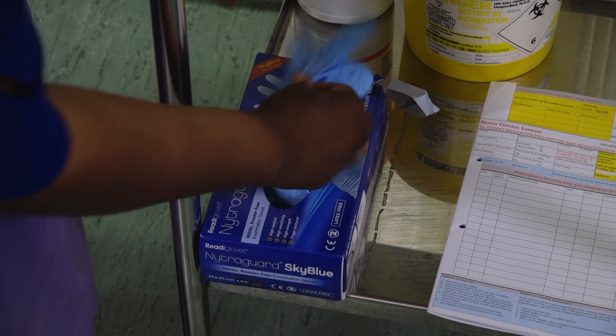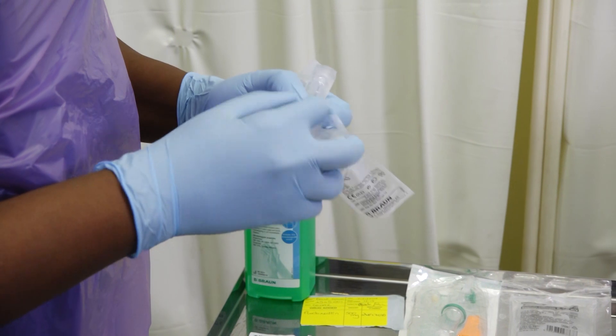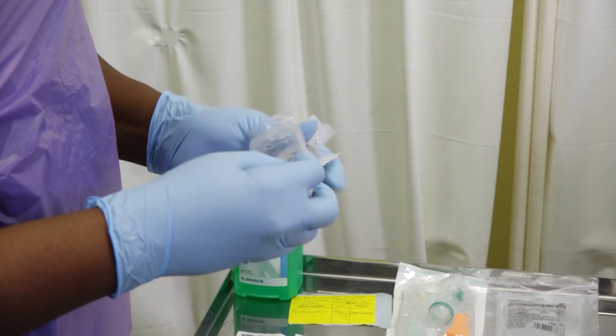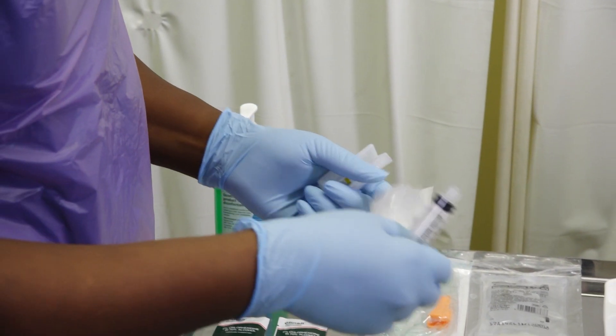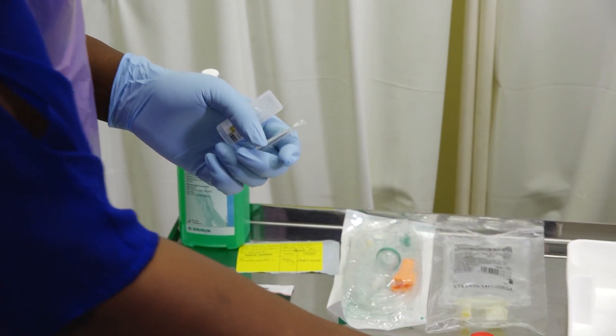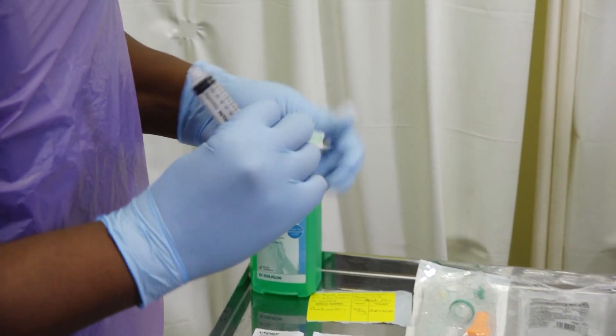Wash your hands and put on the gloves. Prepare the saline flush, placing the syringe back in its packet to keep it clean.